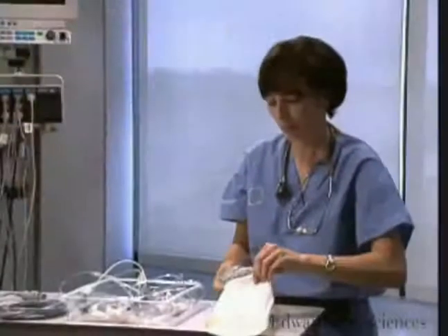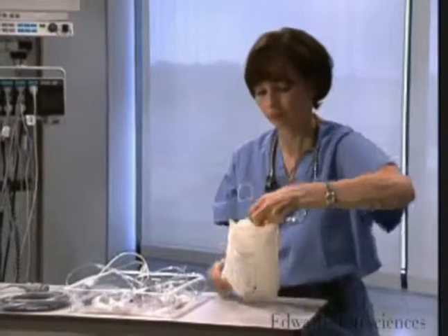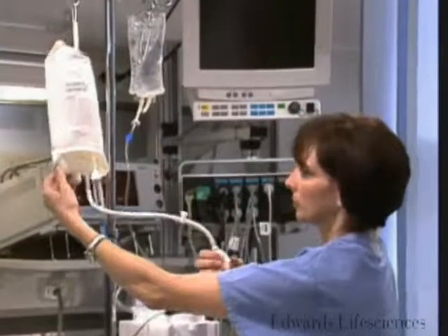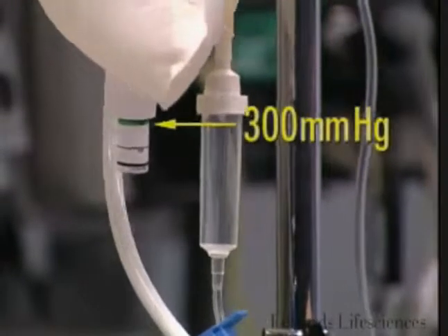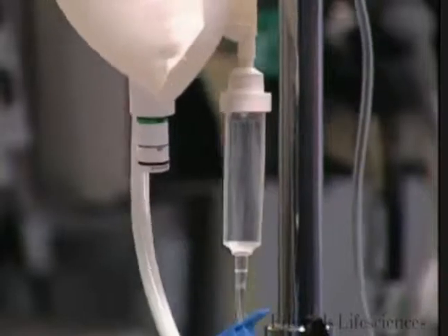A flush device is attached to the IV tubing and connected to the transducer. When pressure is applied to the IV solution bag, the flush device ensures a constant delivery of fluid through the line to keep the system patent. A pressure bag should be inflated to 300 millimeters mercury. This amount of pressure is necessary to ensure delivery of flush solution at the designated rate.